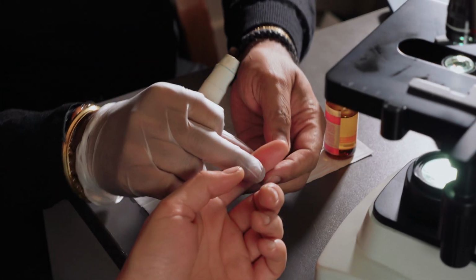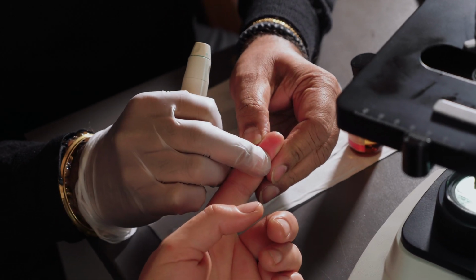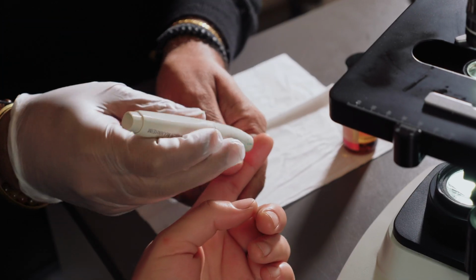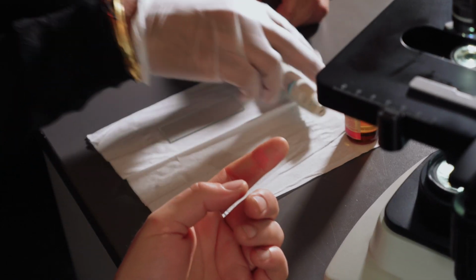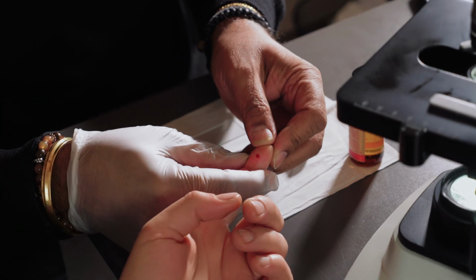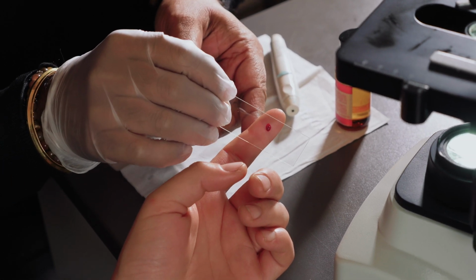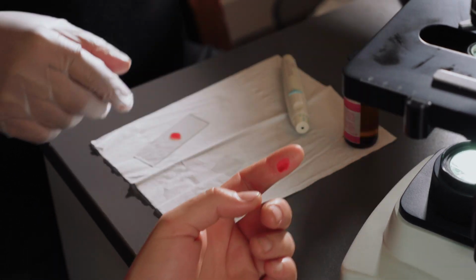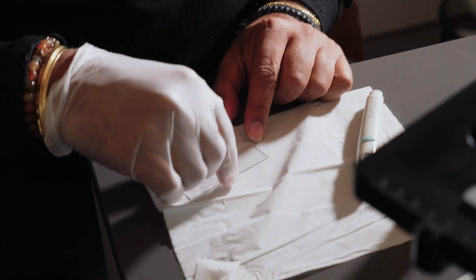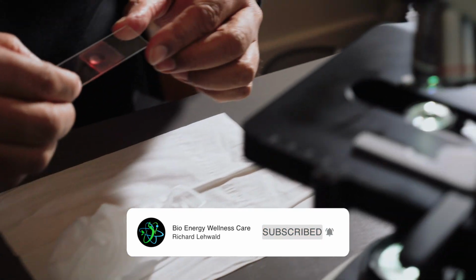Okay, so once again, we're just going to take a little sample of the blood from the finger. Just a little pinprick here. Careful, just hold that flat fully like that. Great, that's all I need. Just apply a little bit of pressure on there. So this is exciting. Let's see what's going on.